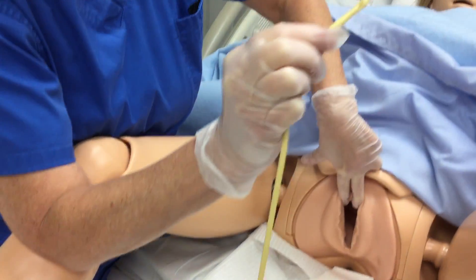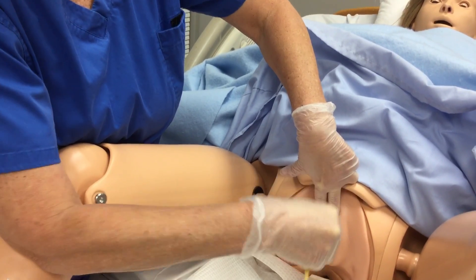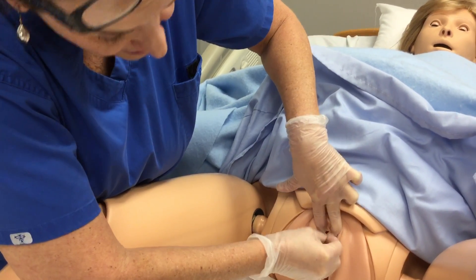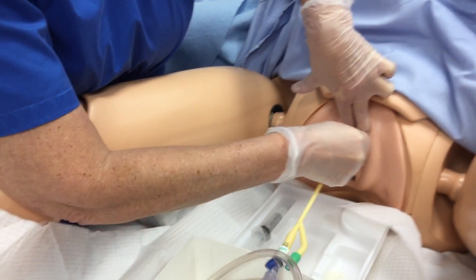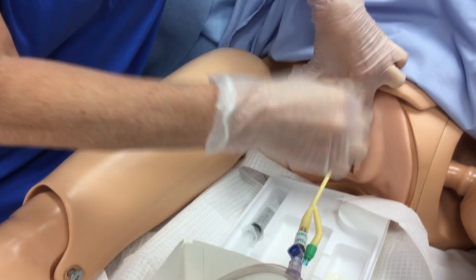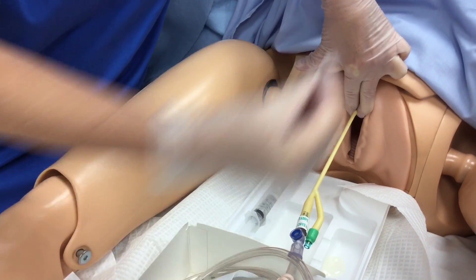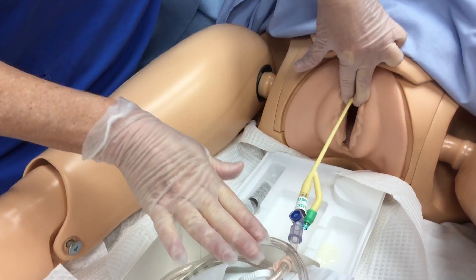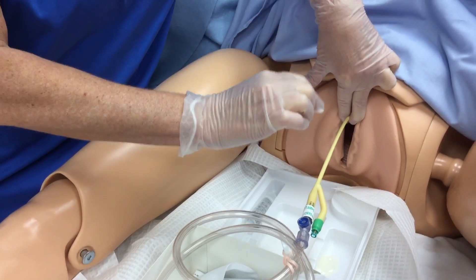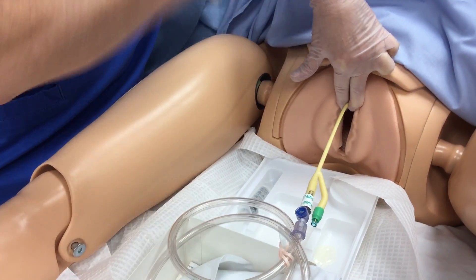Then you're going to take your catheter. Hold it not too close, but close enough that you have good control — if you hold it way back it's going to flop down into the vagina. You're going to feed it into the meatus and go quickly. Don't go slow. It may slide back out when she has a contraction, so don't let go — just keep going. Once you see urine come back in your tube, keep going. Pregnant women have an elongated urethra and you don't want that balloon blowing up in the urethra. Just keep going — it's going to curl up in the bladder. It is not going to harm her.